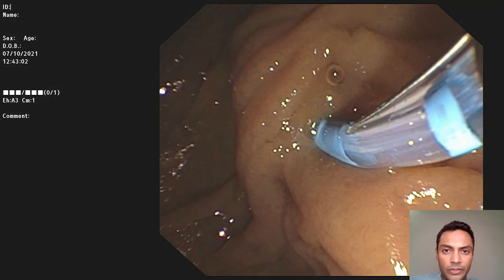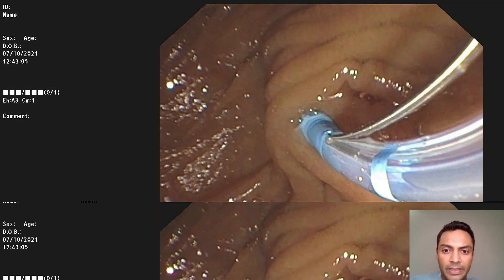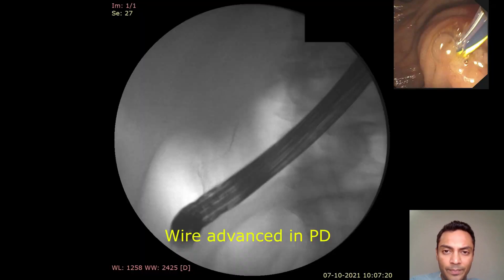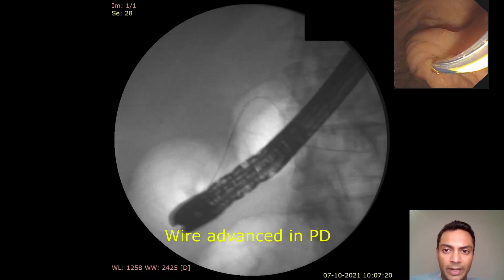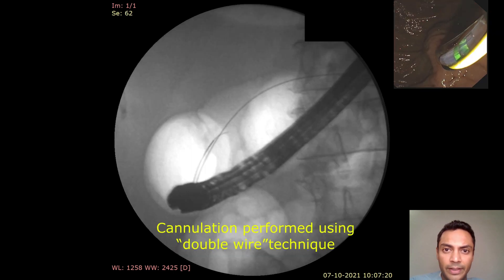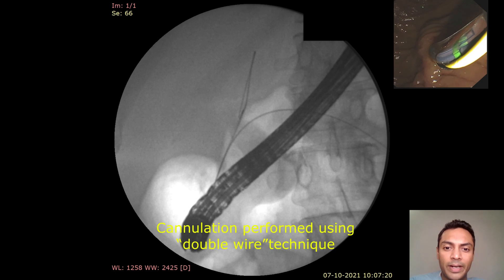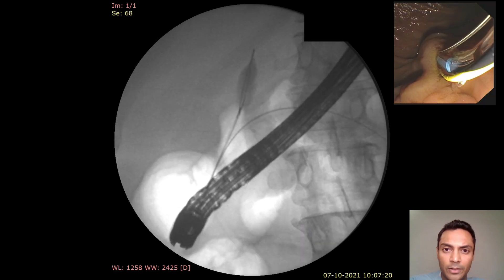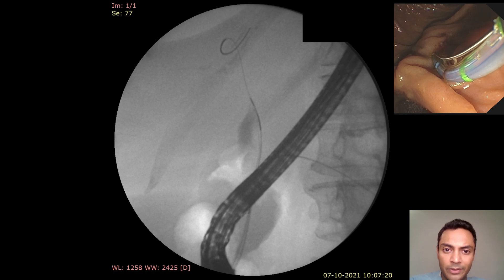She was taken for ERCP. Here we see a long intraductal segment of the bile duct. Initially, a wire was advanced in the pancreatic duct, and eventually bile duct cannulation was accomplished using a double wire technique. Contrast was injected to confirm access into the bile duct.